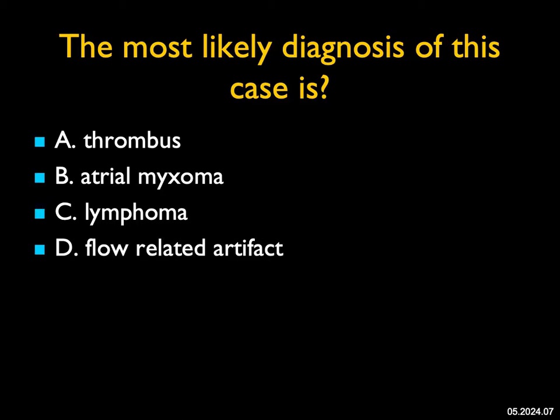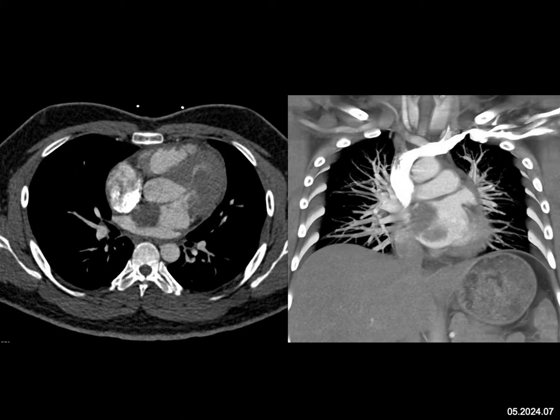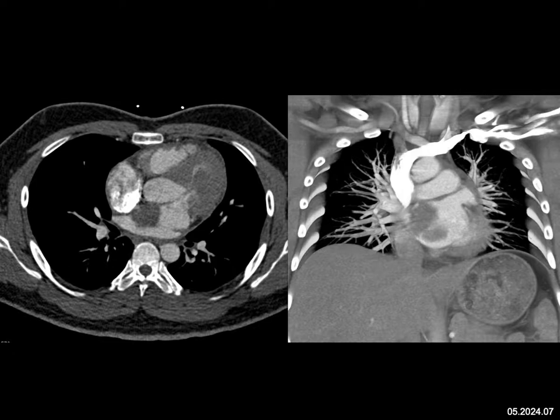The most likely diagnosis: you see a mass sitting within the left atrium, adjacent toward the right atrium. It's lobular, soft tissue density, and not vascular. You could consider a thrombus — though this is large, I've seen large thrombi — but the location pushes you more toward the differential of thrombus versus myxoma. Based on location, atrial myxoma is the best thought.